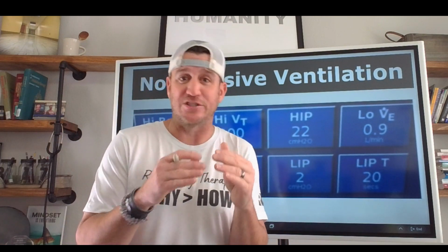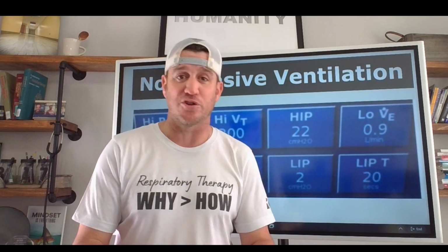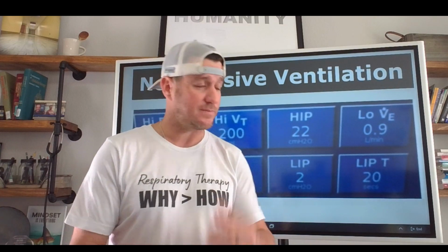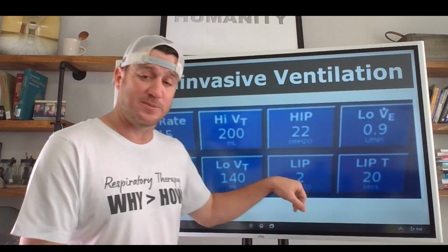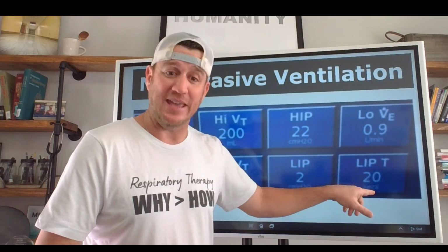But if it's one breath and it fails to achieve that pressure for over 8 seconds, and then the patient puts the mask back on and readjusts it and everything is good, then you're not going to get a low inspiratory pressure alarm, because we didn't exceed the 20-second time limit that we have set here.